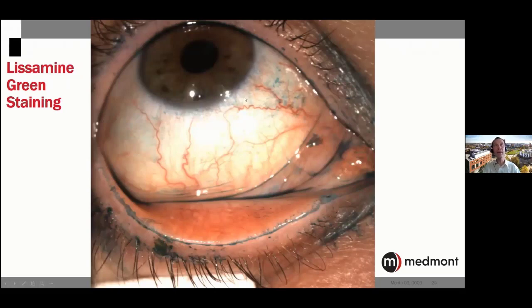So this is actually my eye. So you can see I have quite marked dry eye. You can see significant staining. So I would certainly meet the DEWS 2 criteria. But also we can look at aspects such as the lid margin. So you can see Marx's line here, but actually you can see that there's friction between my eyelid and the ocular surface, which means that we're getting what they call lid wiper epitheliopathy, damage to the cells along this margin. And when we come to remove keratinization, this is also very useful to see where we're going to remove that keratinization from. So really important instrument for making that diagnosis.